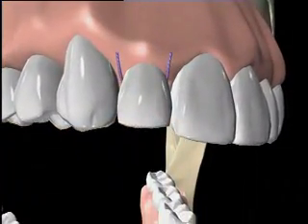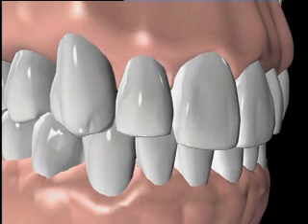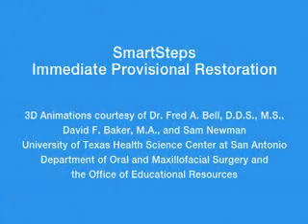Using an aesthetic restoration at the time of surgery allows the gingival contours to be sculpted from the time of implant placement. Performing this technique will allow the maturation of the soft tissue to closely follow the anatomical contours of natural dentition. The SmartSteps provisional restoration technique will provide the patient with an aesthetic result on the day of implant placement, paving the way to practice growth through increased patient acceptance and satisfaction.